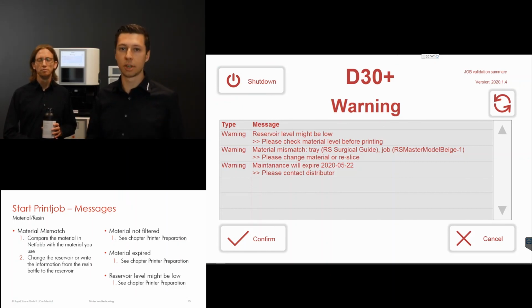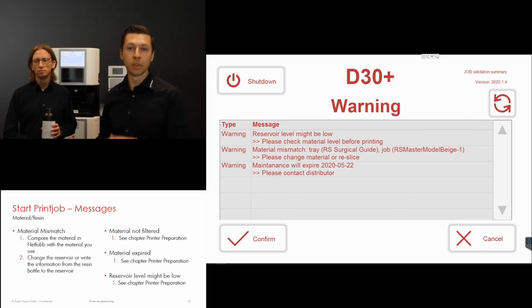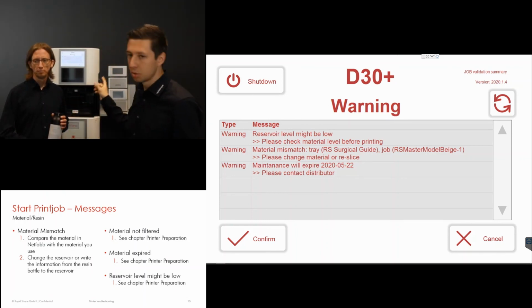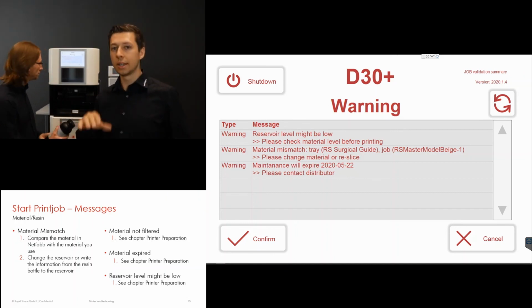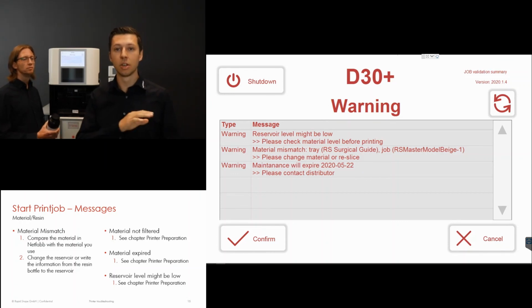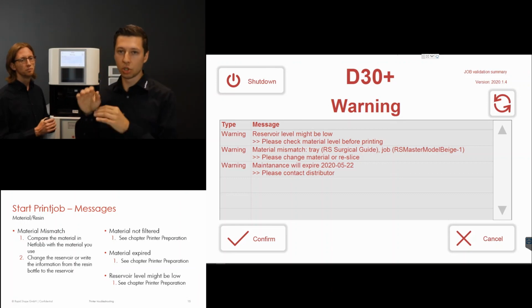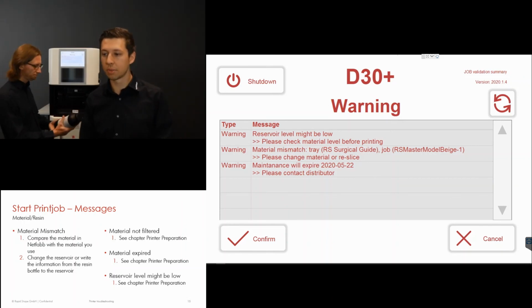If you, for example, have an old reservoir inside because you were printing surgical guide, remove it and put in the reservoir with the master model beige. Or in a case like we have now, we cleaned the reservoir and want to use another material. You also have to rewrite the information from the bottle to the printer. The same will happen when you fill the material: as soon as you write it, the material filling height will be set as maximum, and the reservoir level might be low message will also be gone. Like I said before, the message reservoir material not filtered or material expired can also happen here, and will be shown when you're not solving it while putting in the reservoir. But for now, let's solve the issue. Right. The material mismatch and reservoir level might be low.